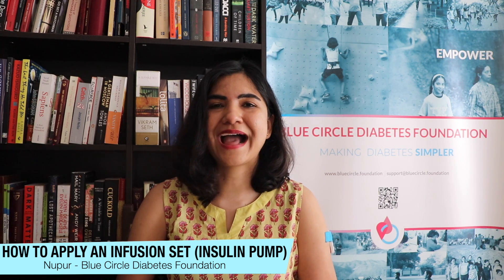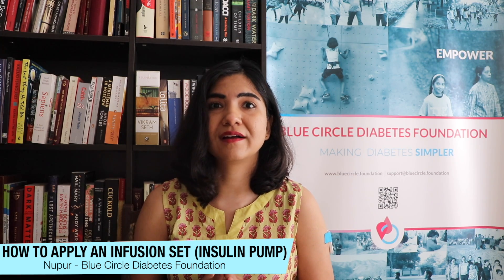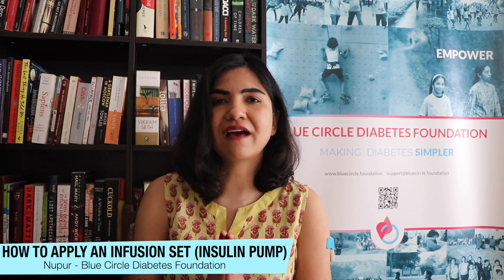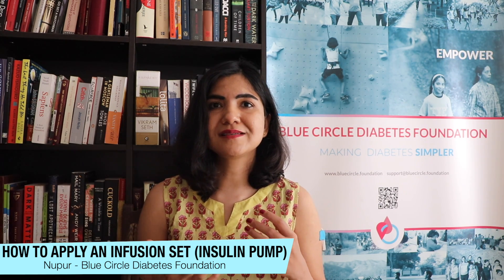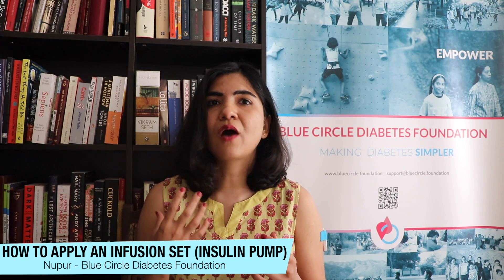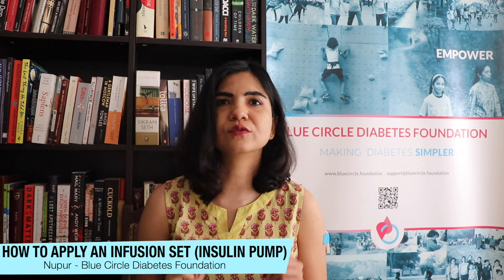Now that I have that out of the way, let me come back and tell you about how to change your patch if you wear an insulin pump. A lot of people have been asking us what an insulin pump is, how it looks, how it works — and here's a quick tutorial on how to change your patch.